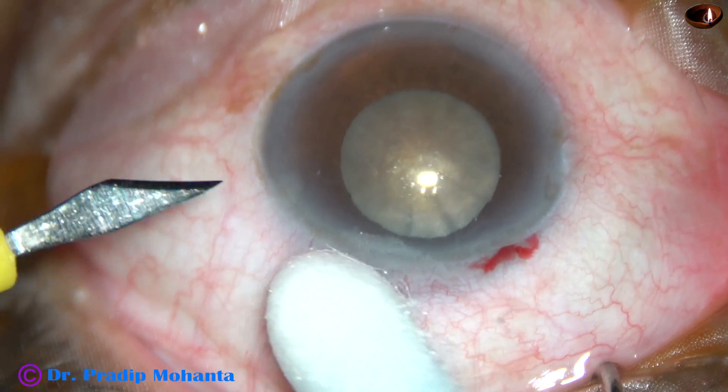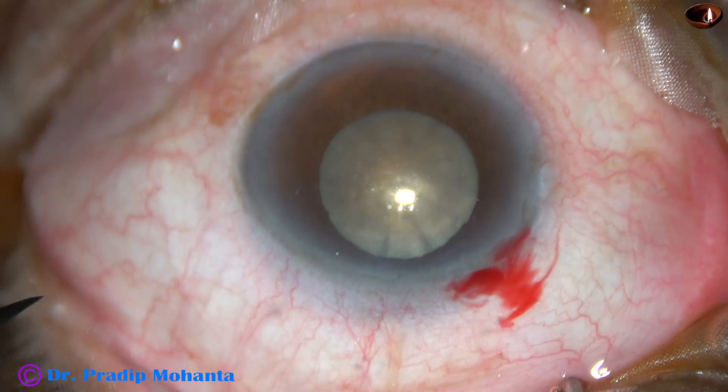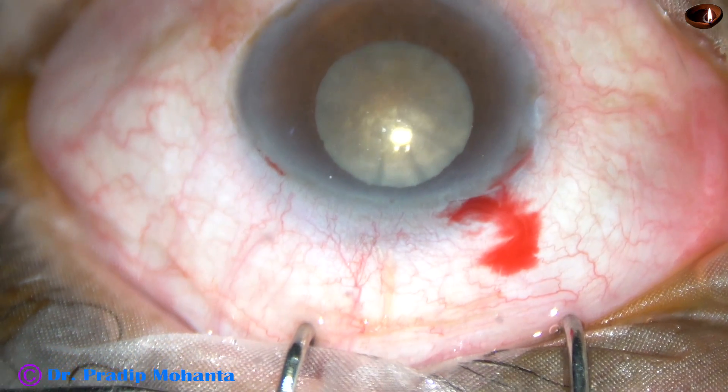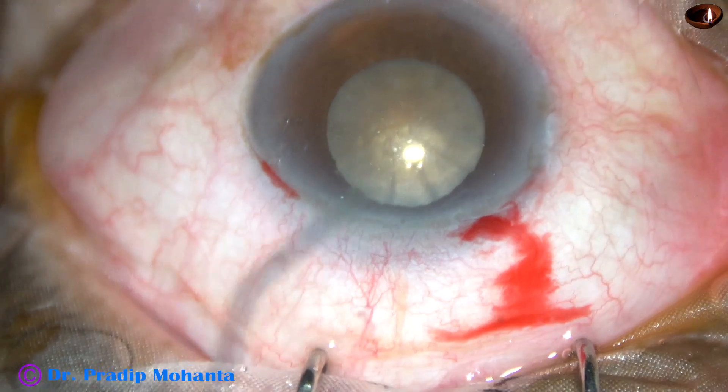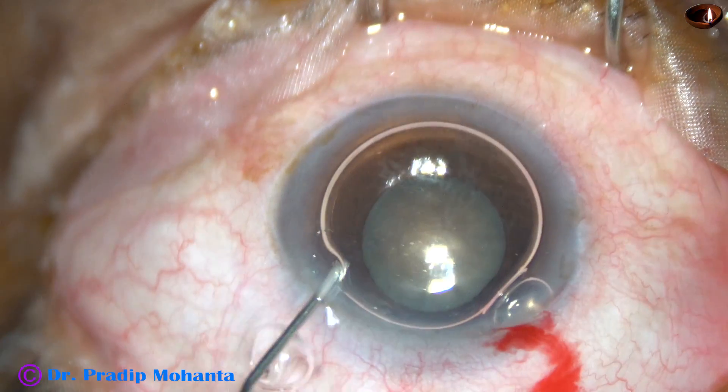By this time the main incision has been made. This is a sideport on the left side of the main incision. And in this case I did only one sideport.